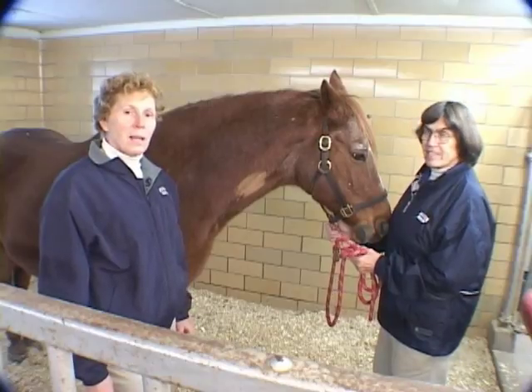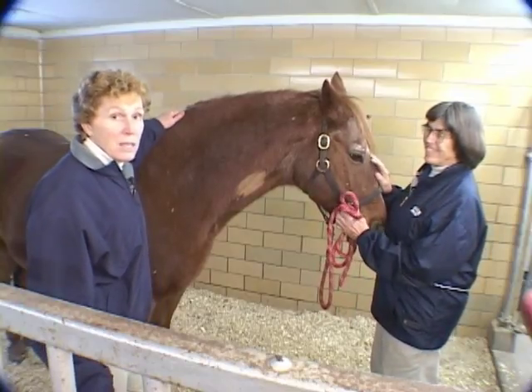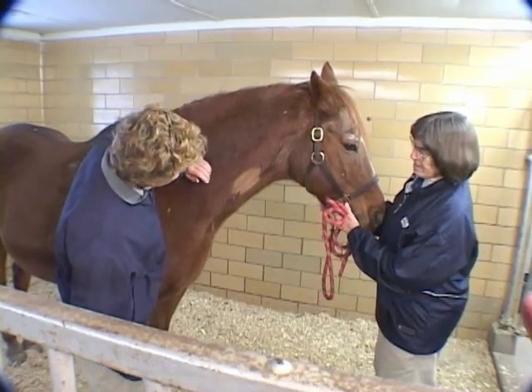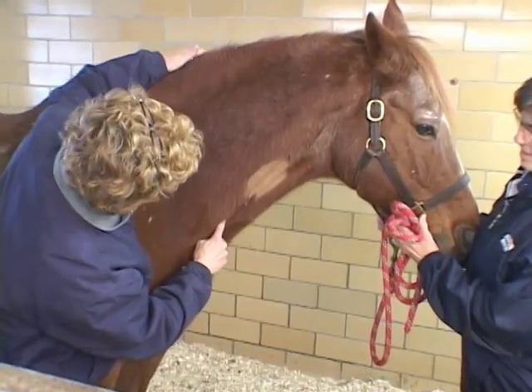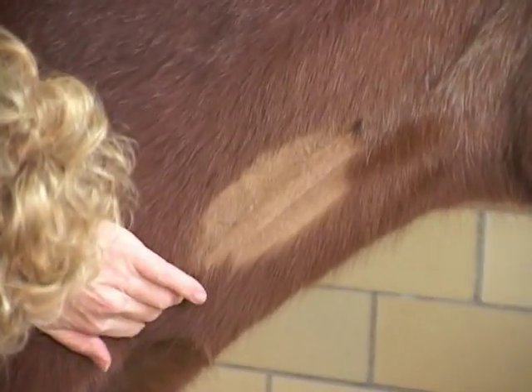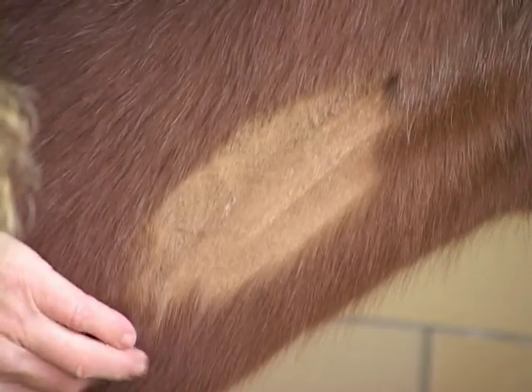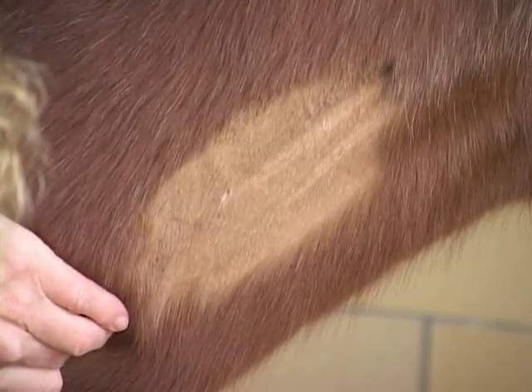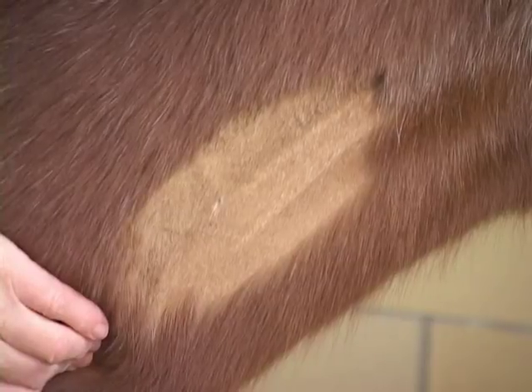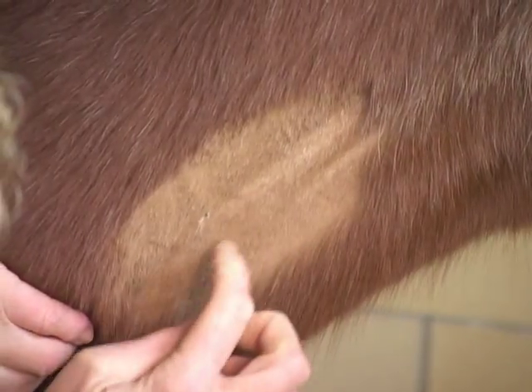Now that we've shown you the equipment, let's show you how to locate the jugular vein. We chose Red here today because he has great veins that are real easy to visualize. We've clipped this side of Red's neck because it's winter and he's got a thick winter coat. The jugular vein is located in the jugular groove running down on the bottom third of the neck. I'm holding it off here so you can see how the blood fills the vein coming up from the bottom, bouncing my finger a little to make it more visual.